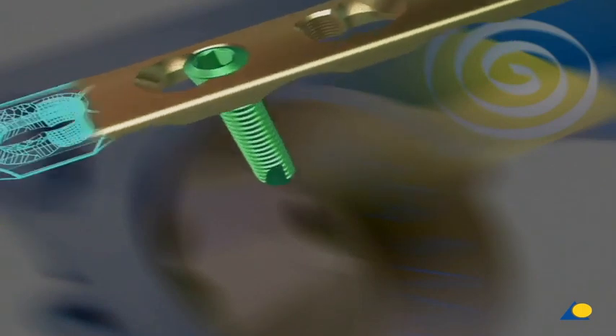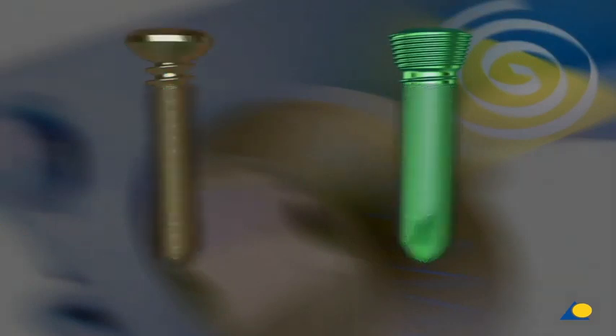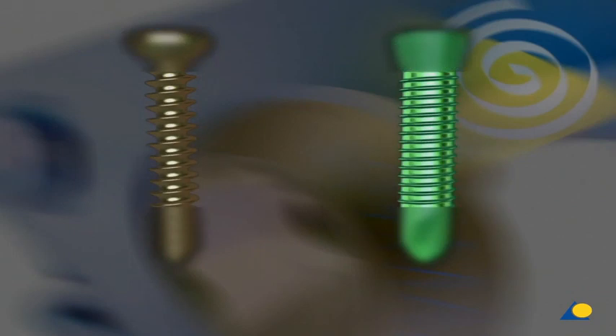Compared to a standard screw, the locking head screw is designed as follows. The head of the locking head screw features a double thread, which allows it to lock in the plate. The thread pitch is the same as the pitch on the shaft. The locking head screw has a larger core diameter than the standard screw, as it has to endure higher bending moments.